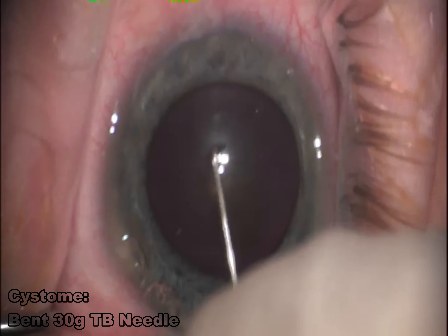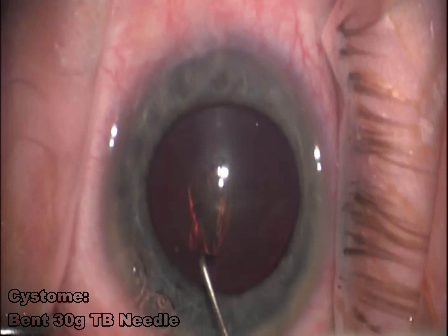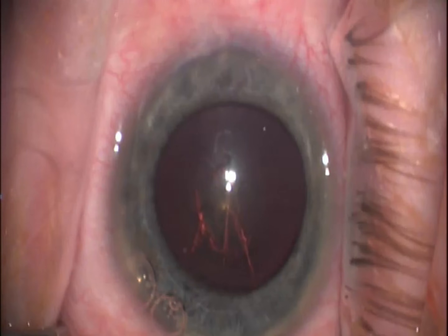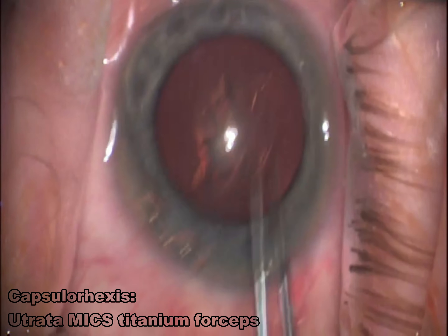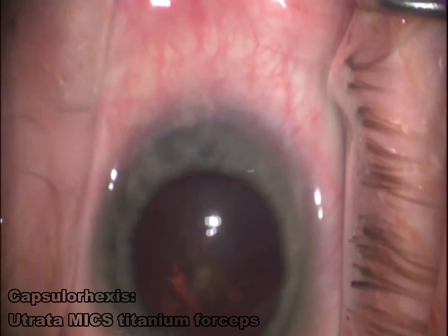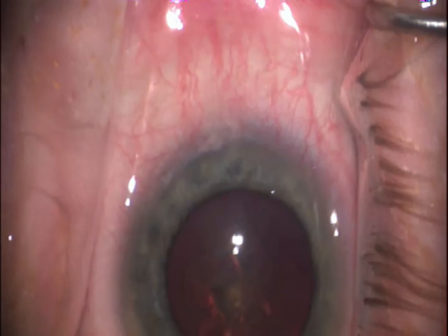I start my capsulotomy with a bent 30-gauge TB needle, just to create that initial incision. I pull downwards towards myself, then rotate and create that flap. I like to finish with a pair of micro-utratas — I find these make a cleaner rhexis and usually go a lot quicker than continuing to use that bent TB needle.